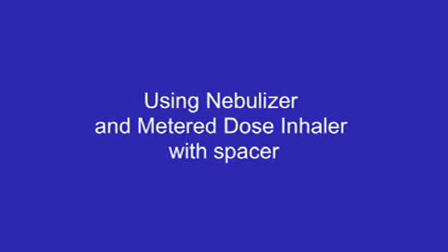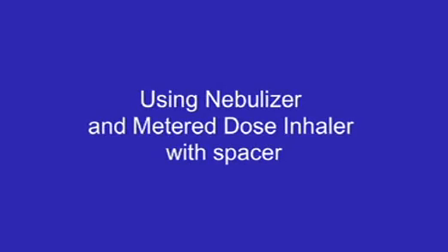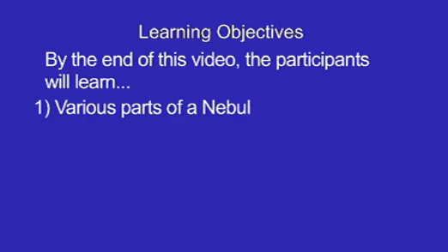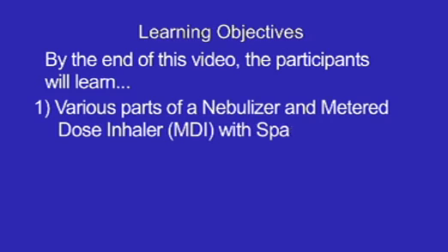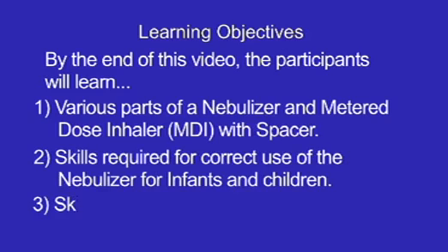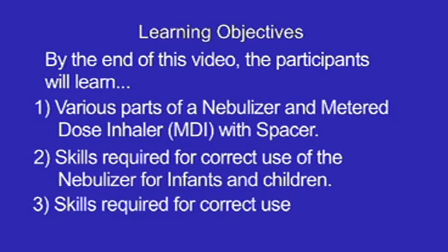Using nebulizer and metered dose inhaler with spacer. Learning objectives. By the end of this video, the participants will learn various parts of a nebulizer and metered dose inhaler (MDI) with spacer, skills required for correct use of the nebulizer for infants and children, and skills required for correct use of an MDI with spacer.